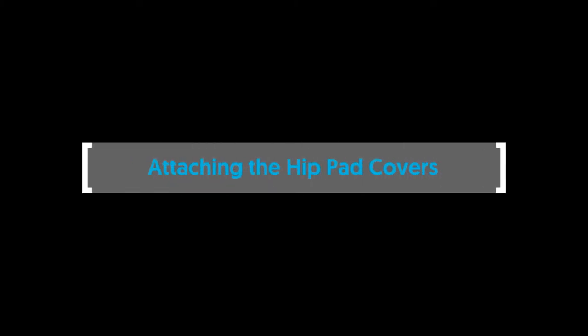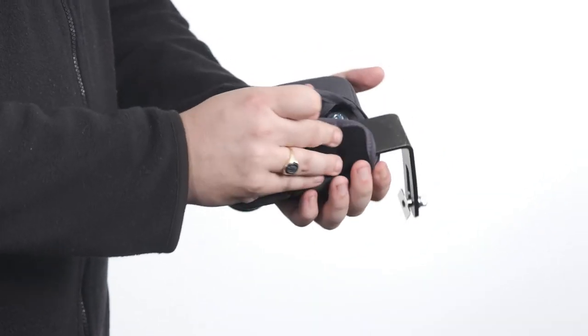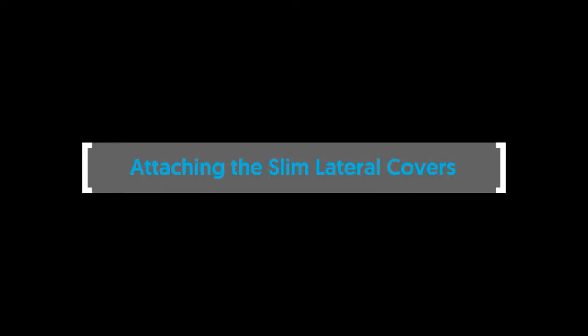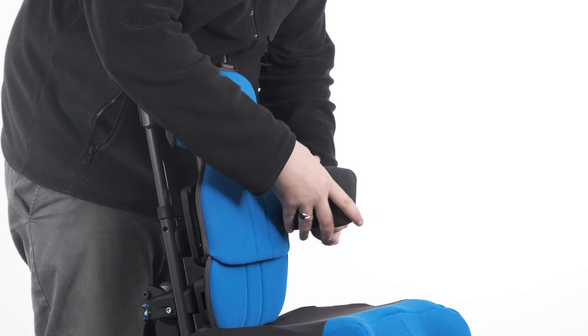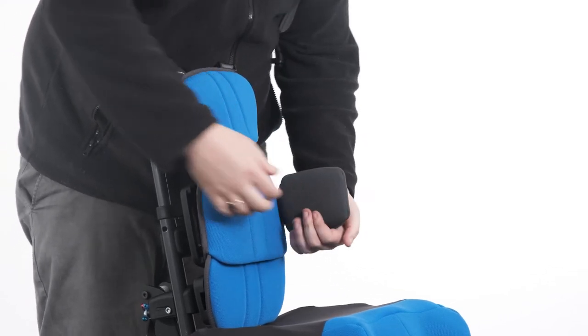Attaching the hip pad covers. To attach the hip pad covers, slide the cover over the moulding and secure in place with the velcro. Attaching the slim lateral covers. To attach the lateral covers, undo the velcro and slide the cover over the plastic pad with the velcro facing downwards. Secure in place with the velcro.